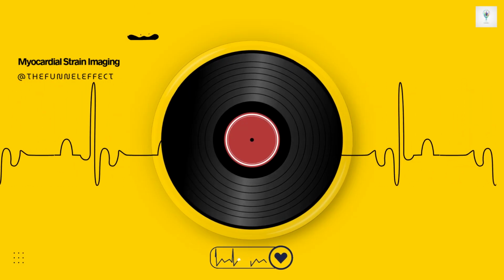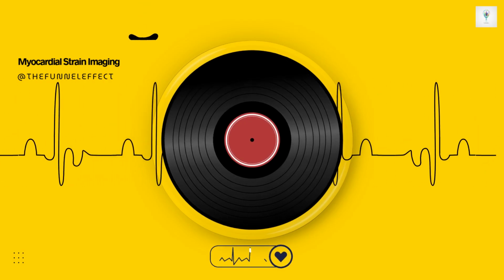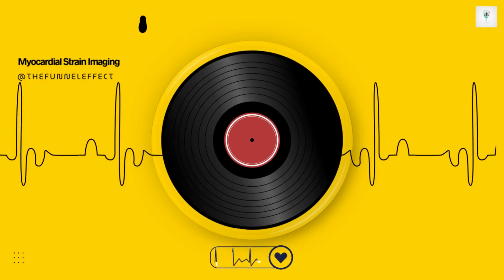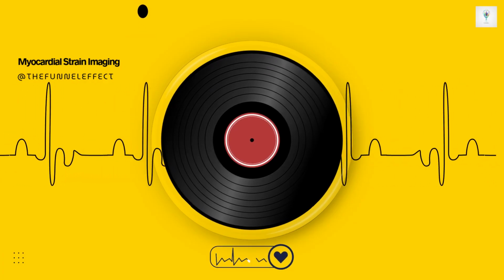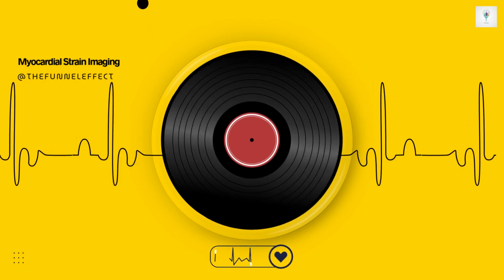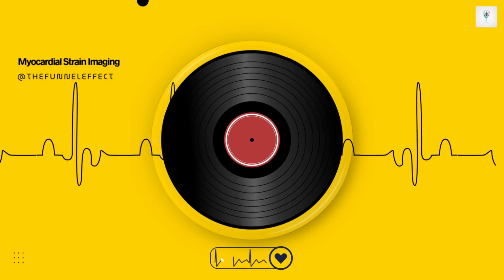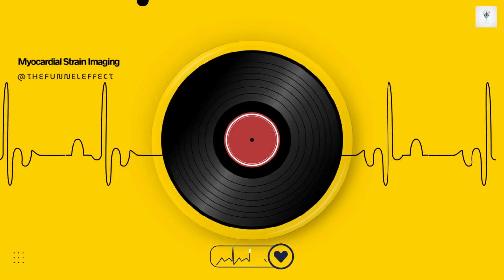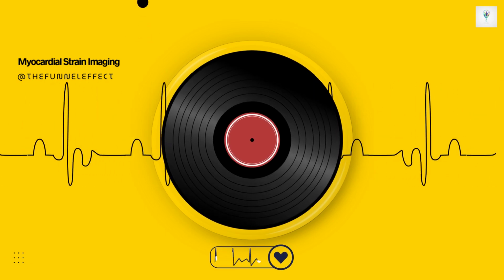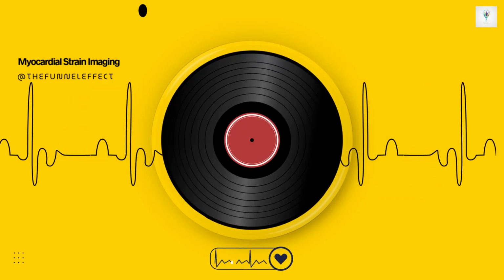Which brings us to the non-invasive era. Cardiac magnetic resonance, or CMR, came next, right? How did that work initially? Yes, CMR was a huge leap. The earliest methods introduced back in the late 1980s were revolutionary. They used something called tissue tagging, or sometimes spatial modulation of magnetization. Catchy name. Huh, maybe not. But the technique was clever. They used specific radiofrequency pulses to temporarily alter the magnetic properties of the heart tissue itself, creating a visible grid of dark lines, or tags, right inside the heart wall.